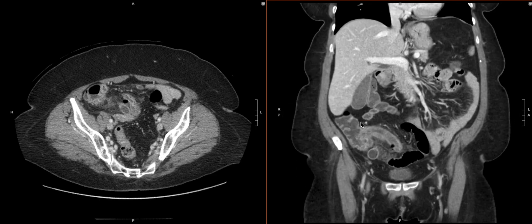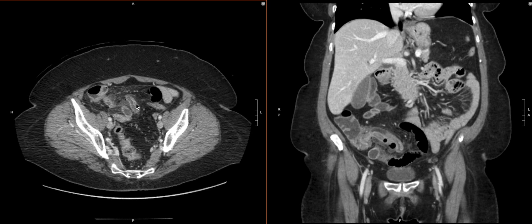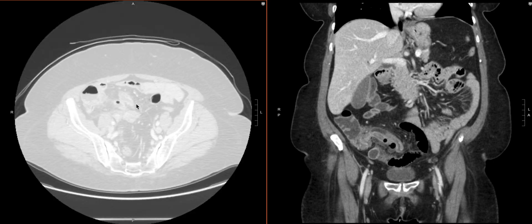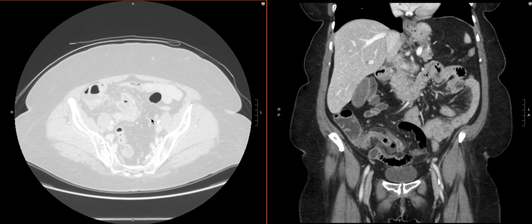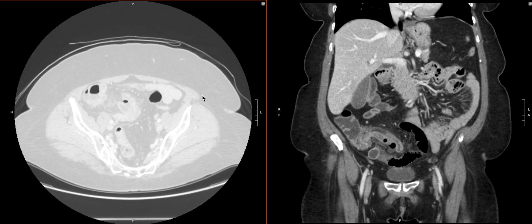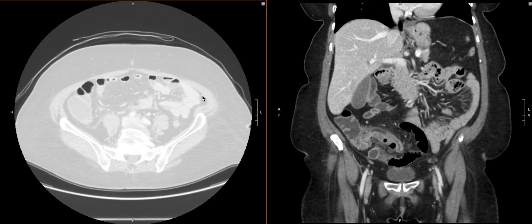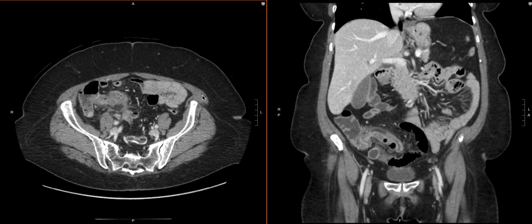But that's not all. If we look really closely, we see that there's something next to the appendix. Right here we can see a little bit of fluid. And when we put it on our lung windows, a little bit of air — that's actually in the appendix. Right here is the air that's outside the appendix. So we have air in the appendix and air outside the appendix. There you go — evidence of perforation, because there's a little focus of free air within some free fluid adjacent to the appendix.